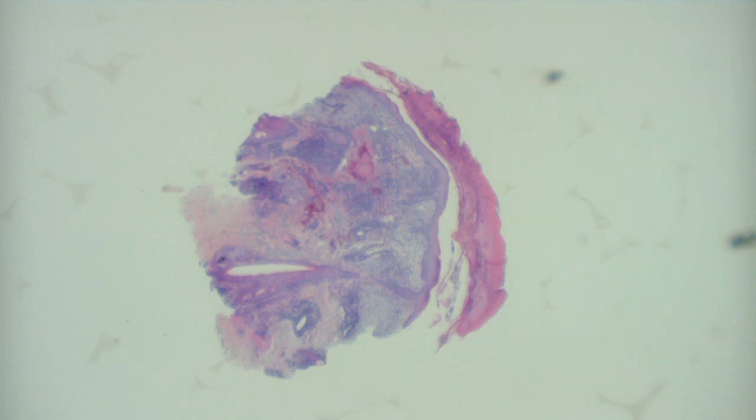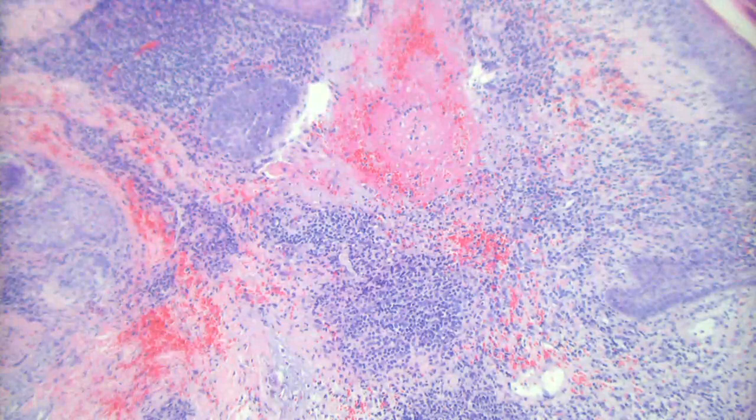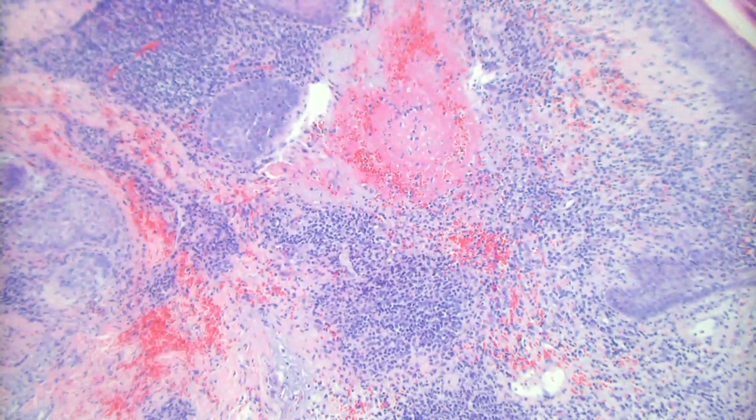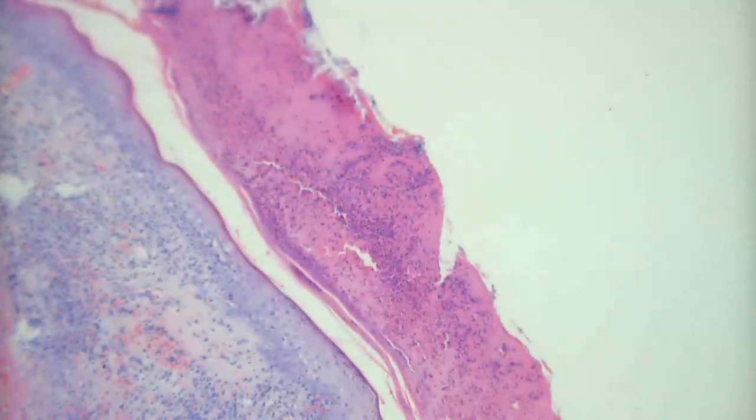This is just like a blown follicle, a folliculitis type, but notice it doesn't really have a lot of suppuration in here. It's got a lot of scale crust. But this is what gets biopsied a lot of times in people that come with an erythematous eruption on the face. It's got a lot of lymphocytes, probably some overlying irritant dermatitis, maybe some sebderm in the background, because that goes along with rosacea a lot of times.